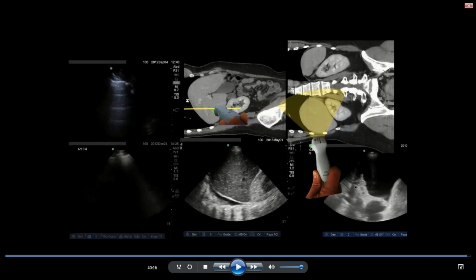Yeah, and that's a great question. This is almost like, when I go rounding, we always joke about this. We all carry different brands of stethoscopes, and we all have different ways of approaching a physical exam. So from my experience, for a pleural-based assessment, I always start out with a linear probe at high-frequency settings.